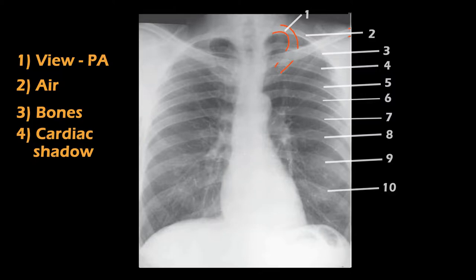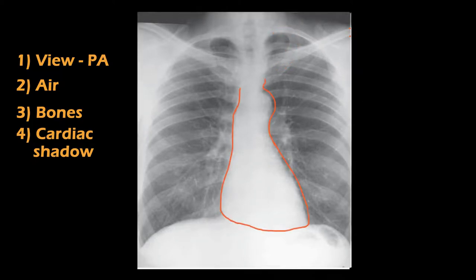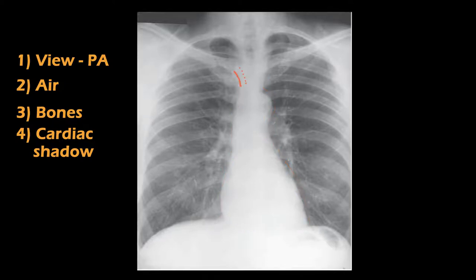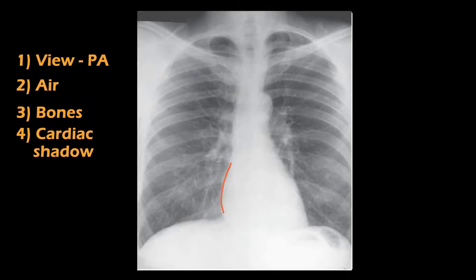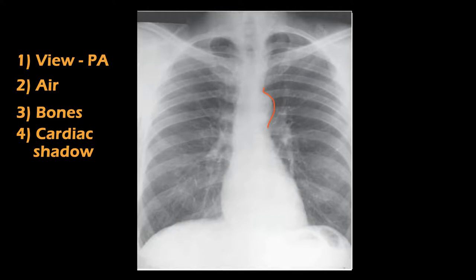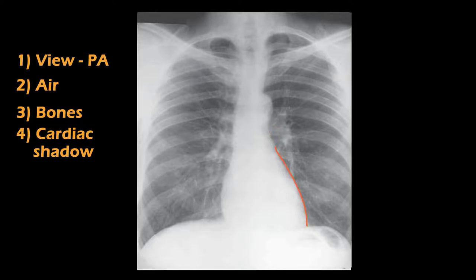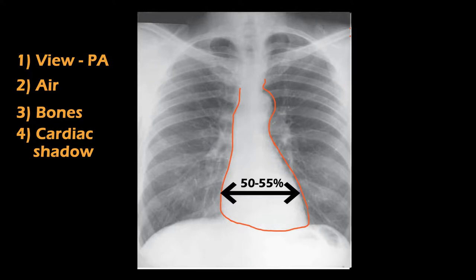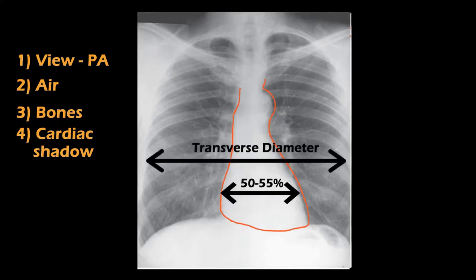C stands for cardiac shadow. This large white shadow that lies in the mediastinum is the heart. The right border from above downwards includes the right brachiocephalic vein seen as a faint shadow, the shadow of the superior vena cava, the right atrium, and the inferior vena cava. The left border from above downwards includes the aortic knuckle due to the arch of the aorta, the shadow of the pulmonary trunk — more specifically the left pulmonary artery — and the left ventricle. Normally, the cardiac shadow is about 50 to 55 percent of the transverse diameter of the thorax; in cardiomegaly, this percentage is increased.